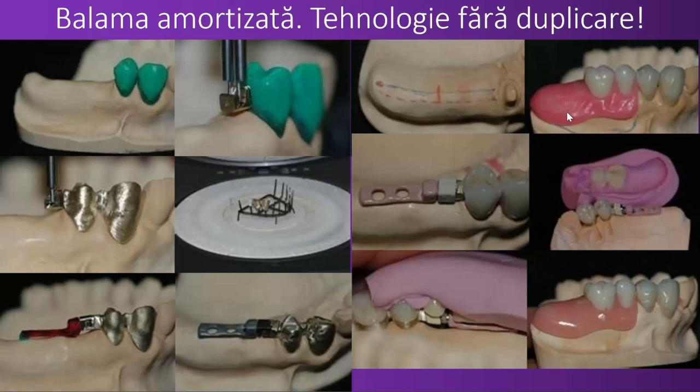It's not true. We have been using it in Romania since 2003 after a long break, because I had the privilege to speak about that with the father of the removable denture in Romania, Professor Andrei Ionescu, and he told me that in 82, 83 he did the first system like that in Romania. So it's not something that new. Since 1980, what is still available to this day? I wouldn't do that again, this type. You see, we have implants now. But anyhow, now we talk about attachments, right?